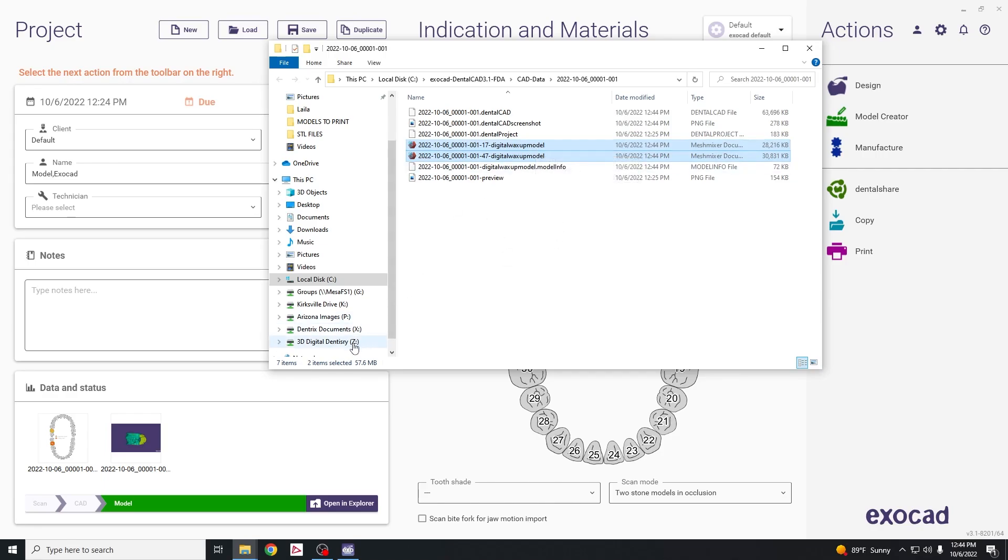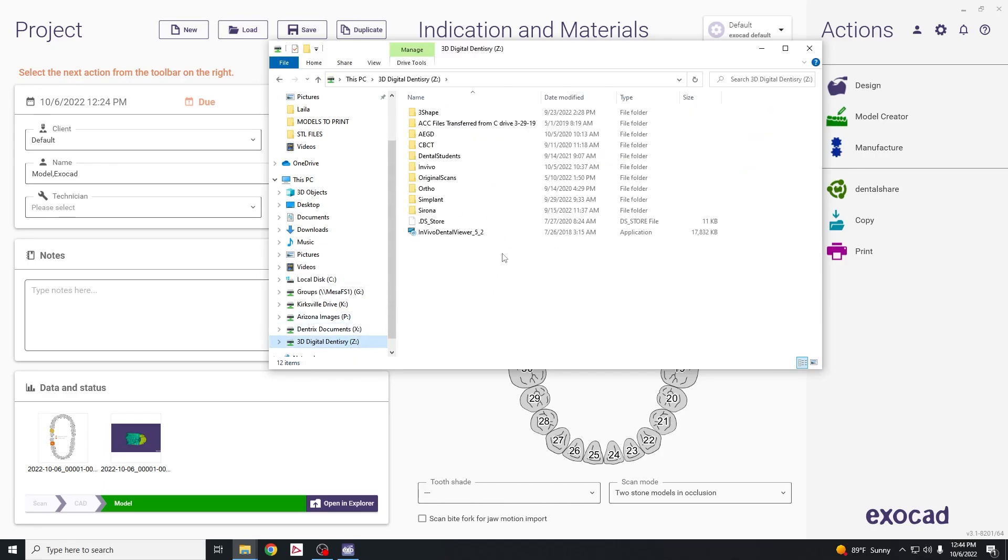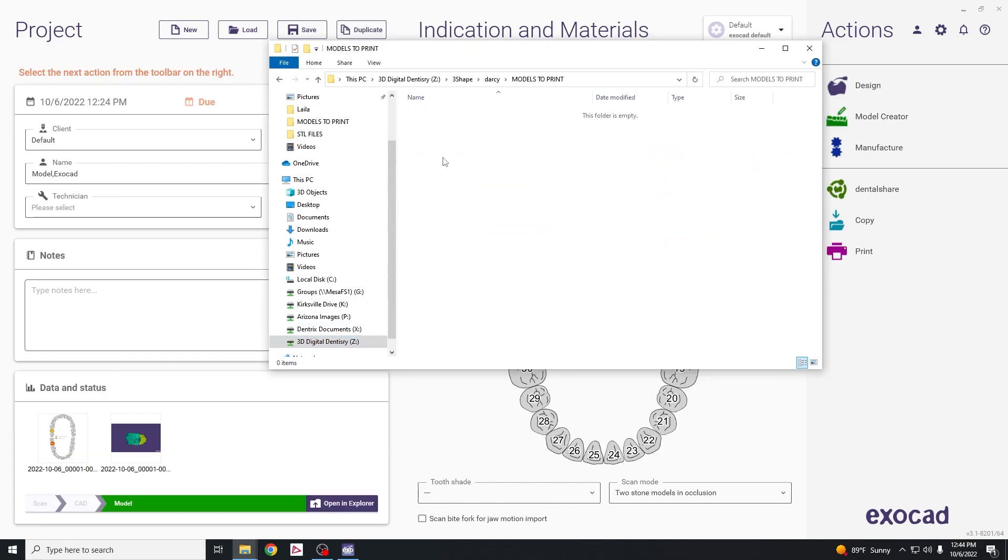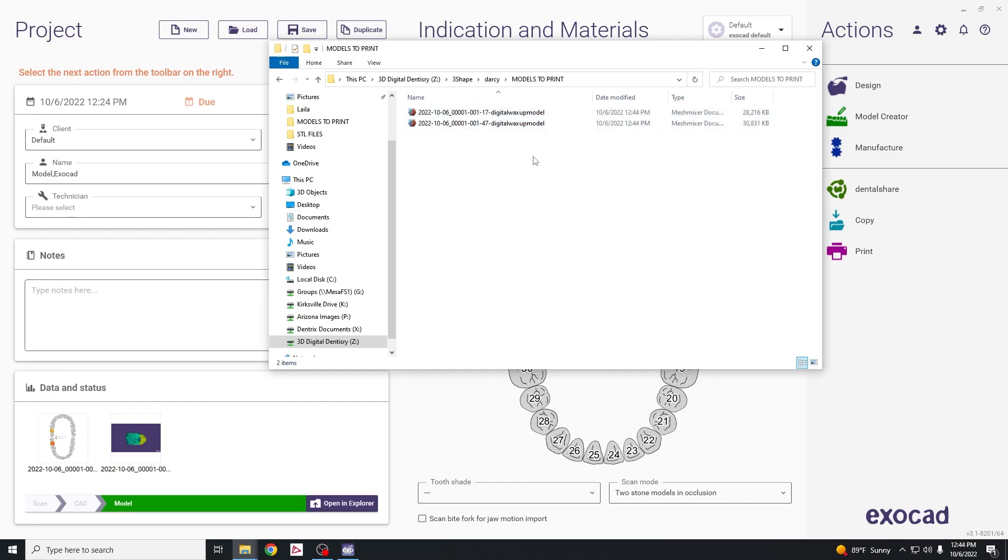Go to the Z drive and click on models to print, then paste this file into the models to print folder.